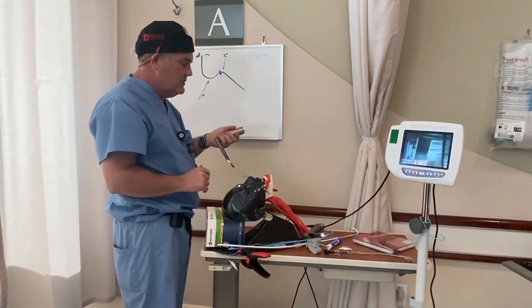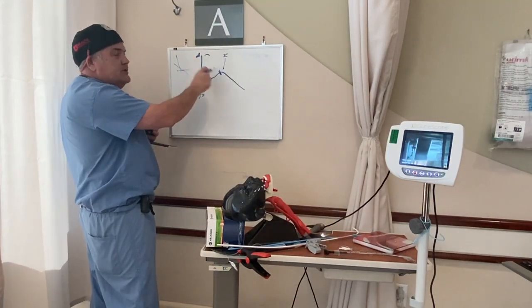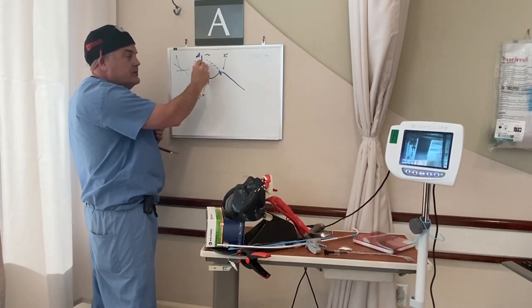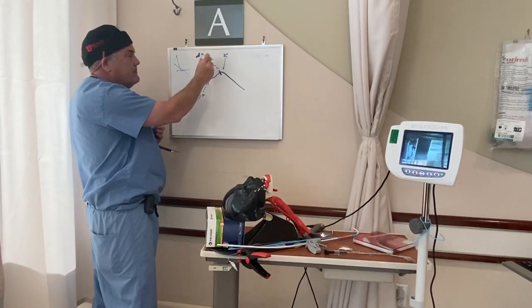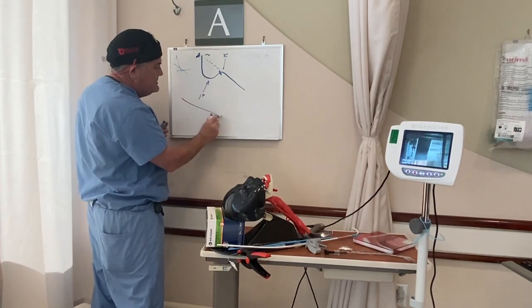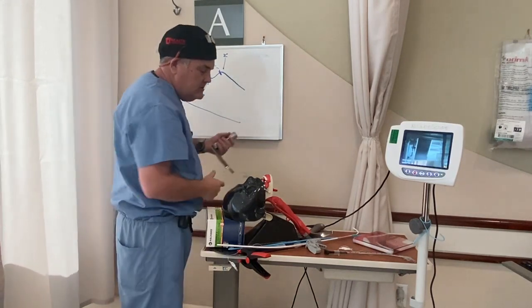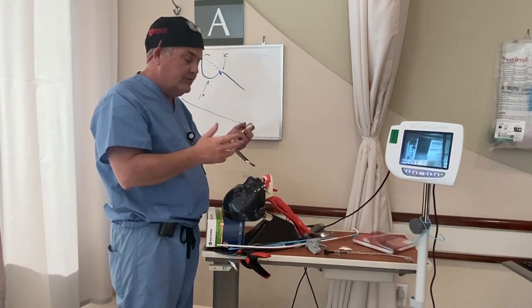With a direct laryngoscope, we change this geometry — we place the blade in and use force to flatten the serpentine geometry. That force lifts the head and relieves the inflection point so we end up with basically linear geometry, giving us linear tracheal access. I ask my residents to focus on the force in both hands to understand what they're doing with the tools.